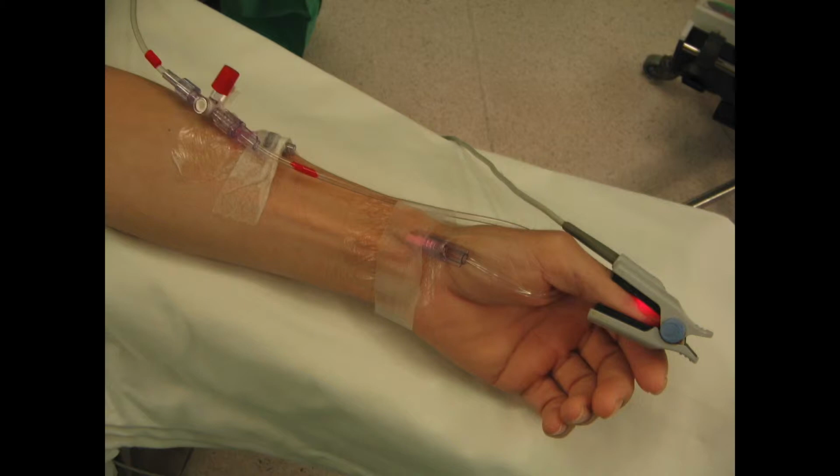Once we've done that, we want to ensure the line is sutured in place. So we want to visually assess the line location. So we're ensuring the line is sutured in place, it's well dressed, it's kept clearly on view at all times. We want to assess for signs of infection, inflammation or leakage, or any distal perfusion problems that we might be having. So we want to ensure that the following conditions are met to ensure ongoing accuracy of the arterial line. So the cannula should be properly placed within the lumen of an unobstructed artery and the cannula isn't kinked or blocked. The arterial waveform should be evident on the monitor.